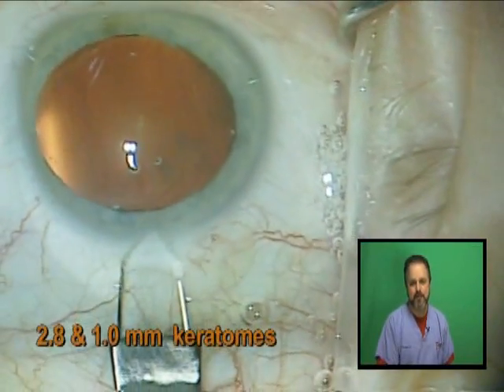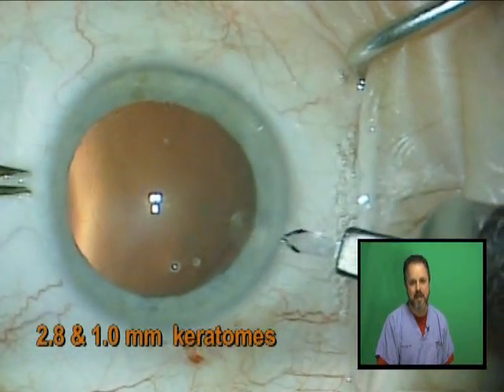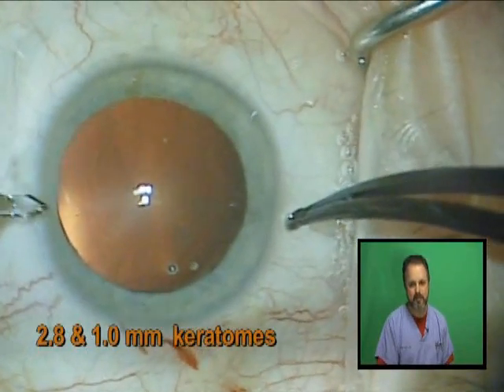I then prefer to make my main keratome incision with a 2.8 millimeter keratome. Then I prefer to make two small paracentesis incisions on either side of the main wound.